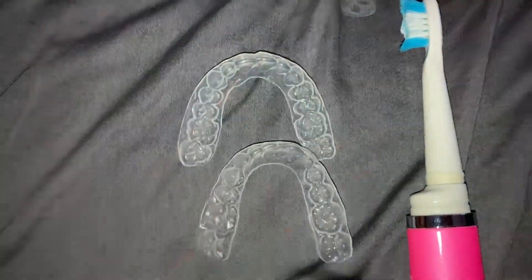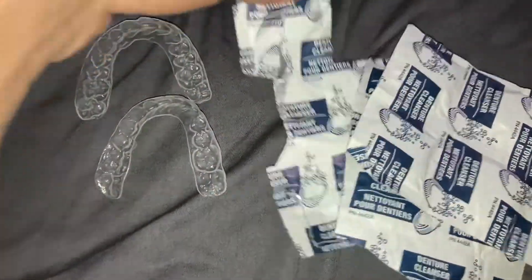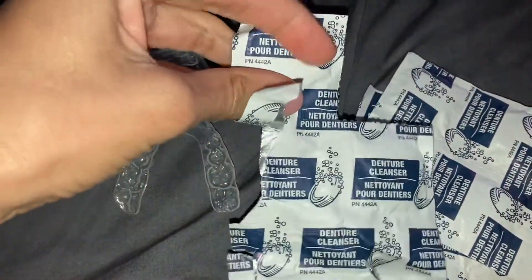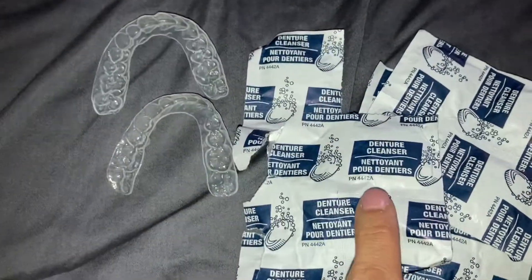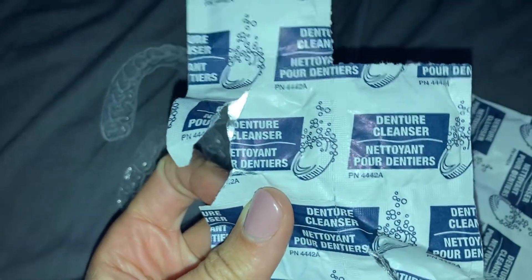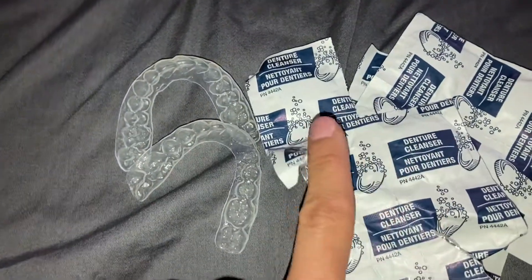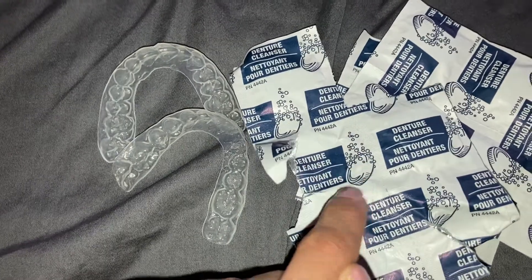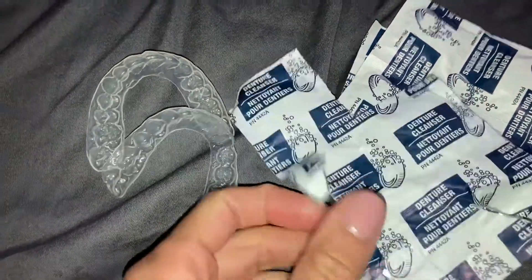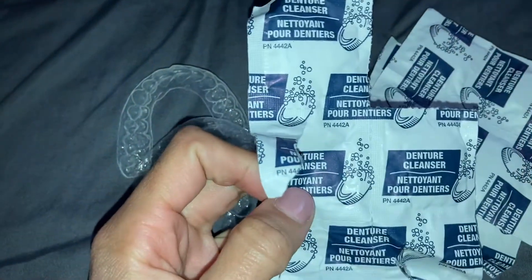The second option — especially if you're sick or want to deep clean your retainers — is denture cleaners. Don't get one with whitening in it. You could also get Retainer Bright; they sell it on Amazon, literally everywhere. If you get denture cleaners, they're not specifically made for your retainers, but it's not going to harm them if you get the correct one. Use more water than the denture cleaner — you really want to dilute it. This is not an everyday thing; this is for a deep clean.